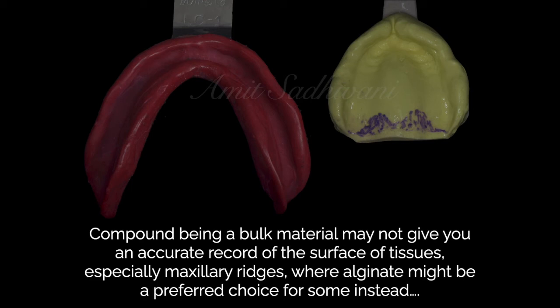So the fine anatomical landmarks and features of the edentulous foundation may not be recorded with impression compound, especially on maxillary ridges, where alginate might be a preferred choice for some people.